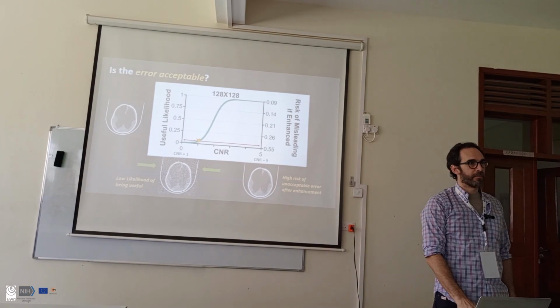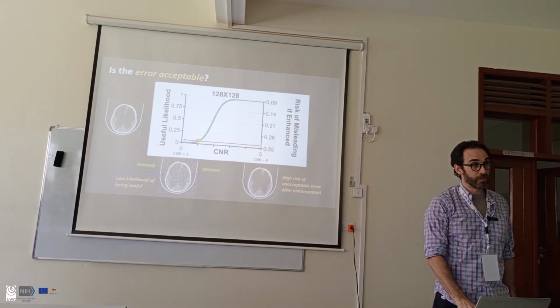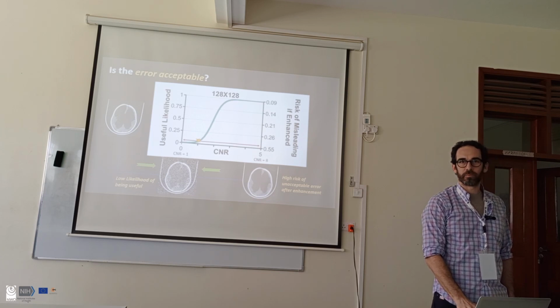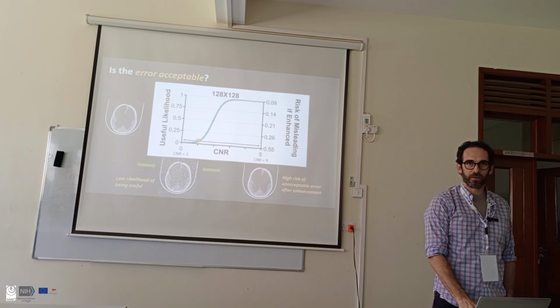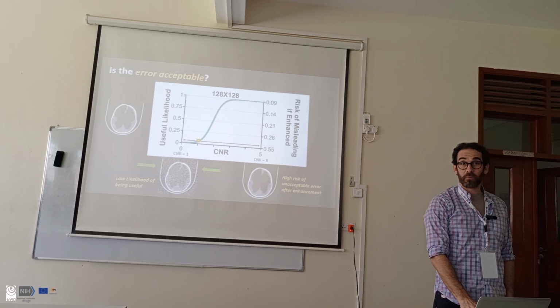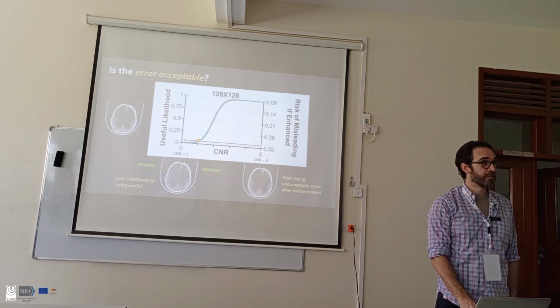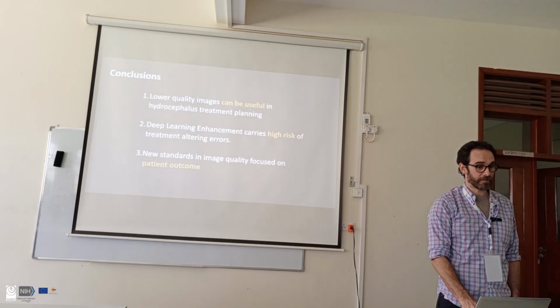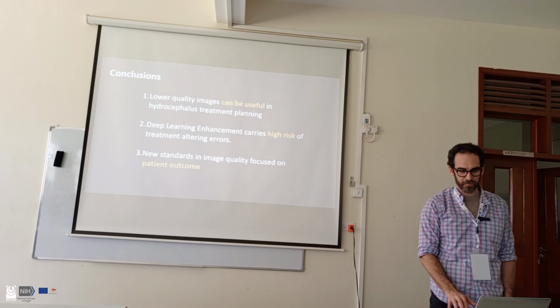Now, we only tested one machine learning network. We had 80 images to train on. So this is not to say that we should all dump machine learning. I think there's a huge place for machine learning in all of the medicine that we're trying to do now and in processing. But it's an important risk to highlight. It's not a magic pill that we can put our low quality stuff into and end up with really high quality results. So I think it's very important to understand.